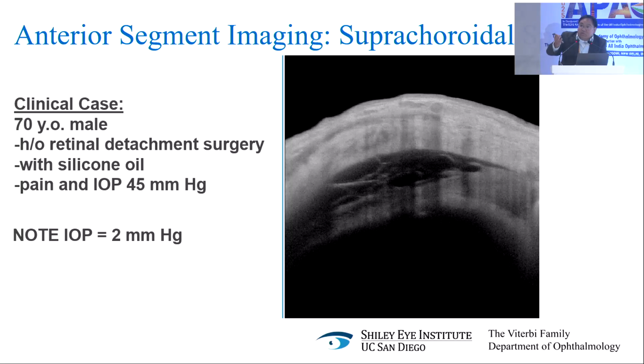As we were discussing with Dr. Azrani in the last session, if the ciliary body is detached from the posterior direction, you can have decreased aqueous humor production. And so in this case, now we know that the problem of why the pressure is low is basically right there. This is also a very interesting picture to me because you have all this stranding.